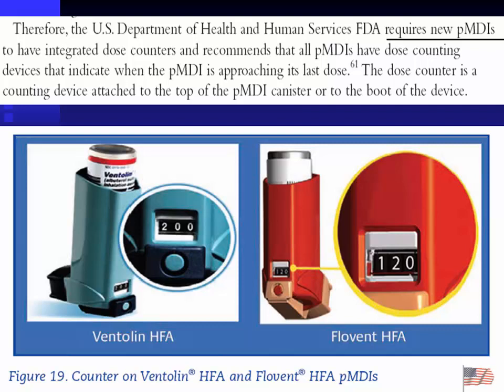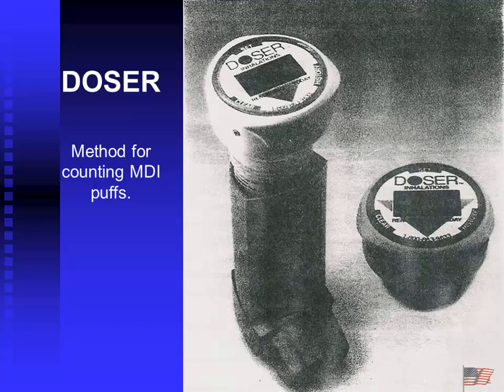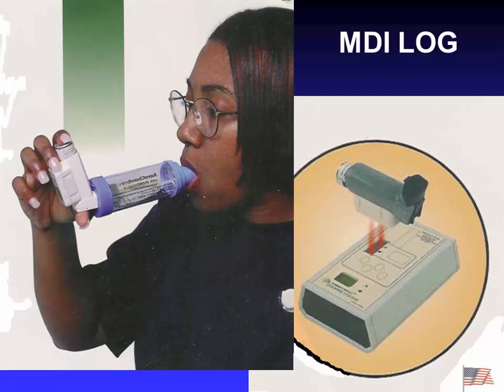Here's an example of the counters that you have. They'll track the number of doses or number of actuations you have. And again, they can come in multiple designs. Here's another one. And this is one where actually a highly sophisticated computer program is going to track them.